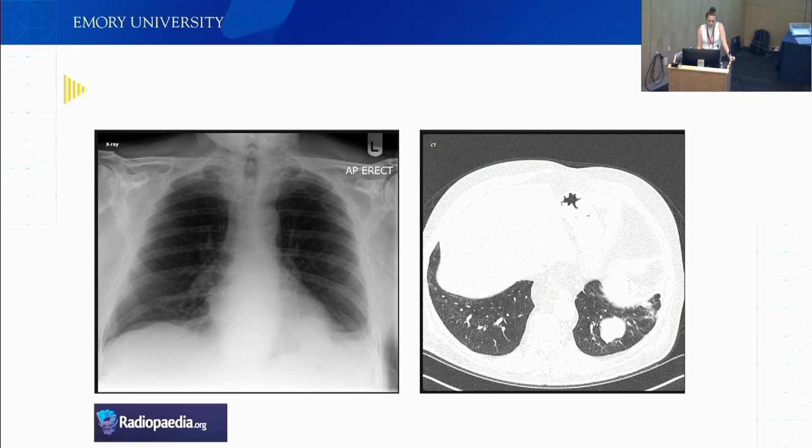And also consider the duration, right? So if it's a malignancy, right? Because sometimes you won't have chest X-ray and CT on the same day. What's your practice? Is it within a 3 month span, or is it pre or post, right? Yeah. So we'll talk a little bit about that.